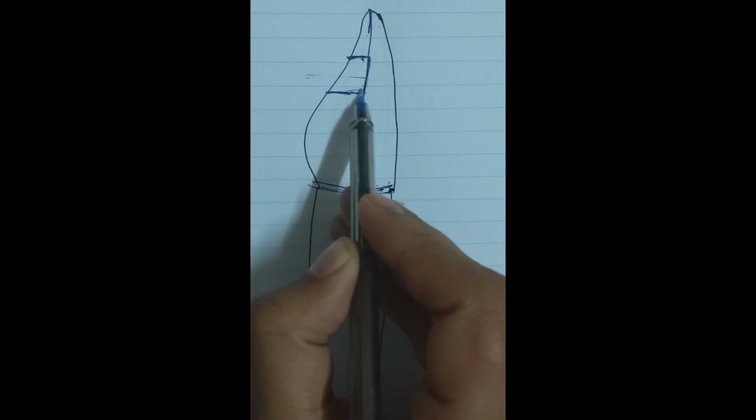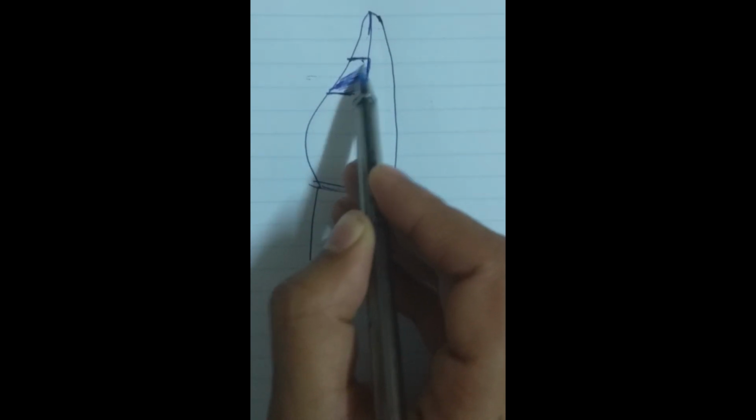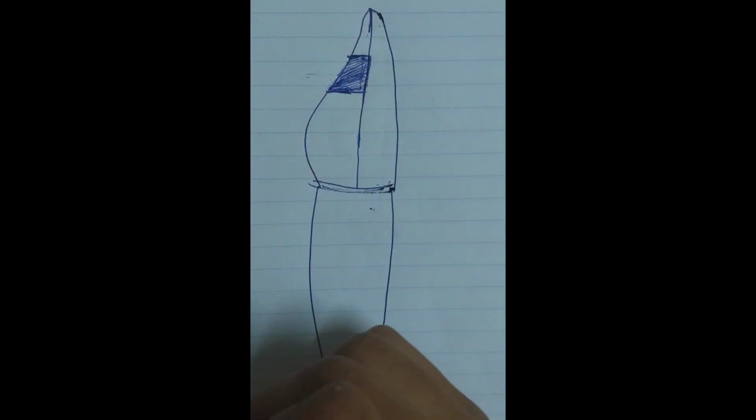This is all enamel. We will remove it by our preparation. Hopefully I made it clear for you, and see the video to know the detailed way for our preparation in lab.